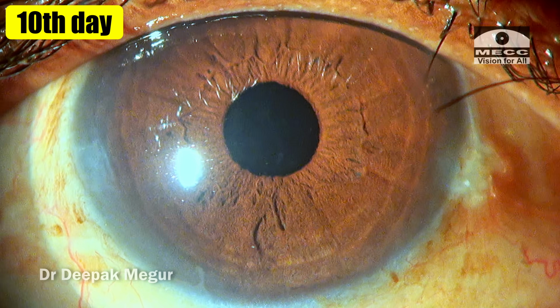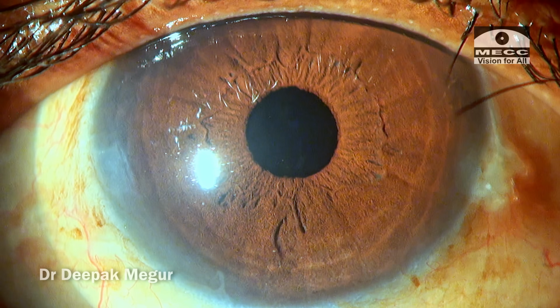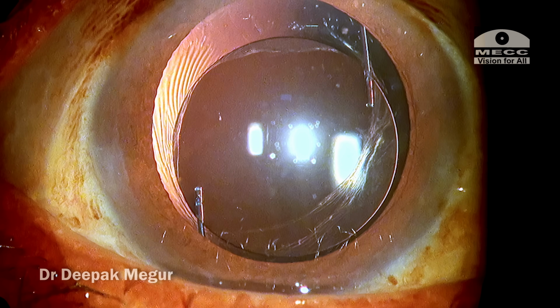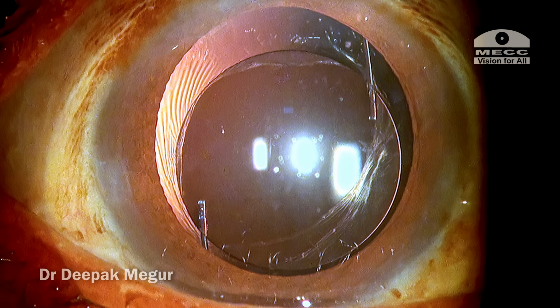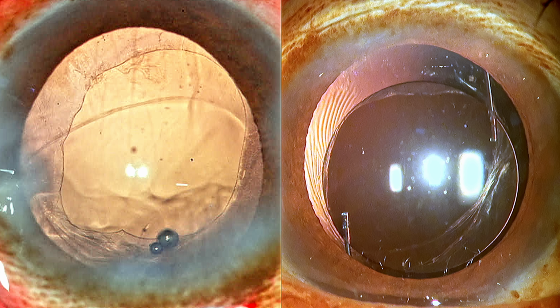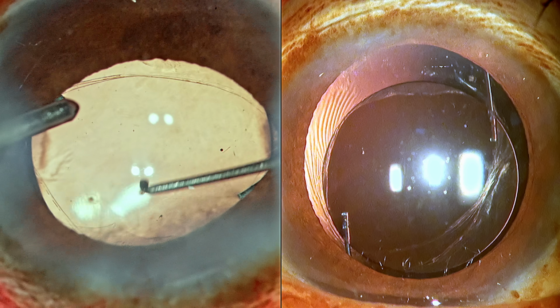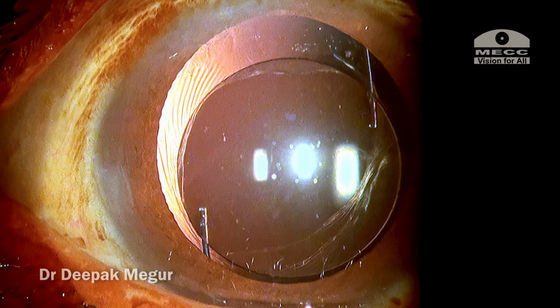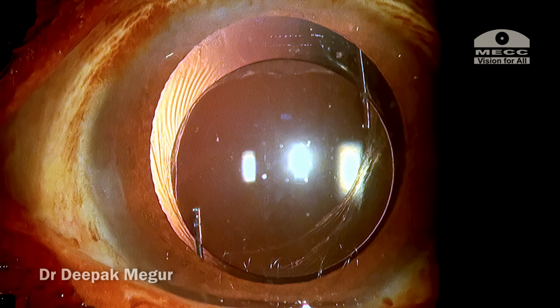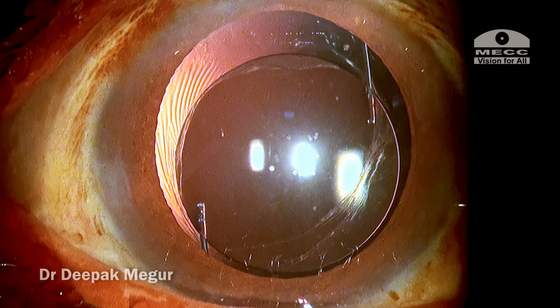Now, these are the post-op pictures on the 10th day, and this is the undilated view, and this is a picture with a dilated pupil. After dilatation, the intraocular lens looks a bit decentered, but the lens is not decentered. It's actually the rhexis which is decentered, and the optic is captured in this decentered rhexis. That's the reason why it appears slightly decentered. But achieving an optic capture is critical as it ensures long-term stability in a better way. And the patient is being monitored.